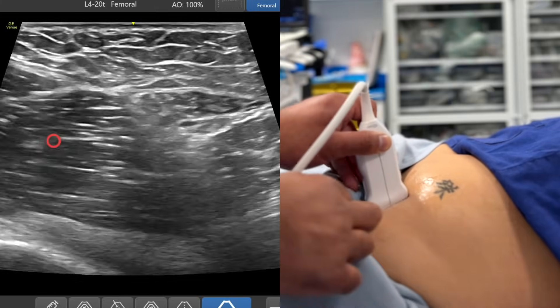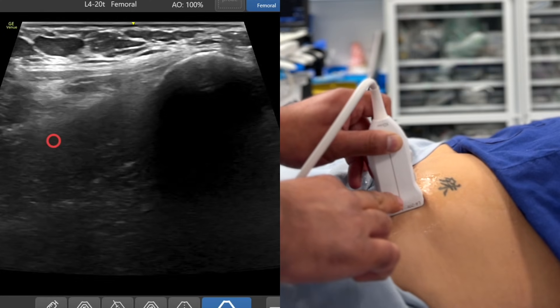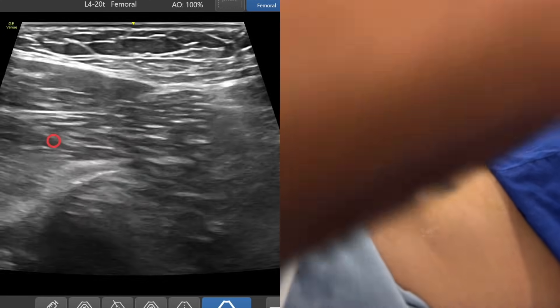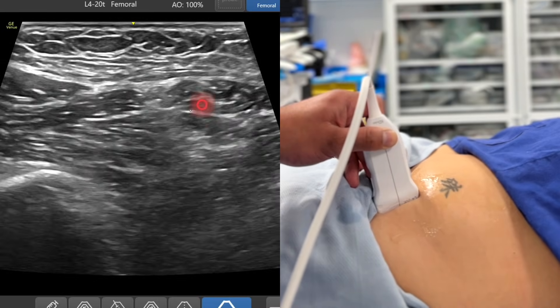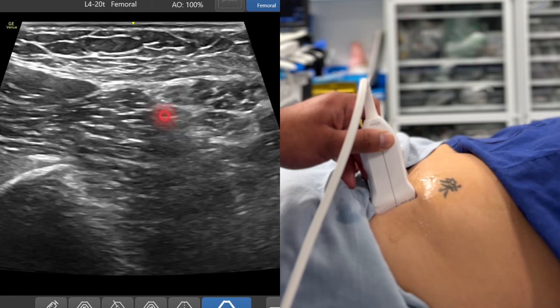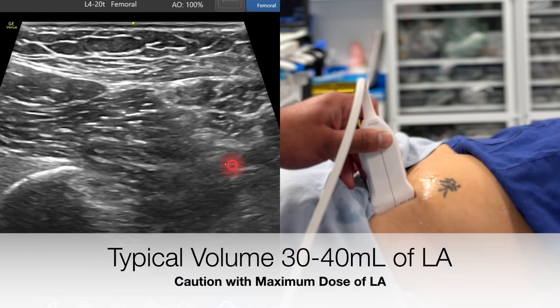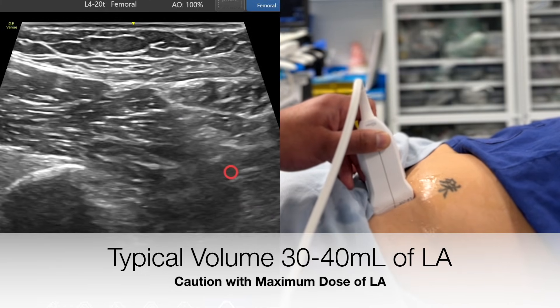So for the suprainguinal fascia iliaca block: the probe starts off on the anterior superior iliac spine, slide off towards the midline. Infralateral you've got the sartorius, here's iliacus, and here's internal oblique. You want to bring your needle in from infralateral to supramedial, injecting local anesthetic deep to the fascia of the iliacus, so local anesthetic dives down that way, and you want to be deep to the deep circumflex iliac artery.